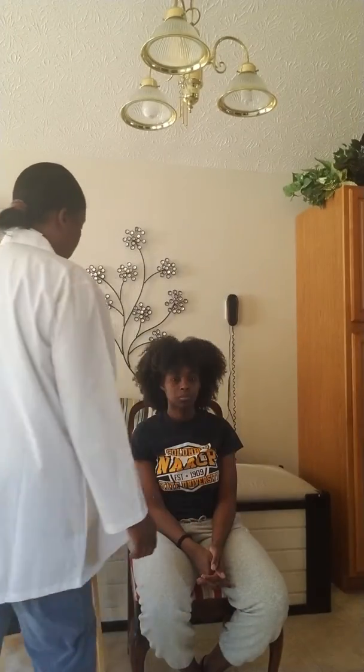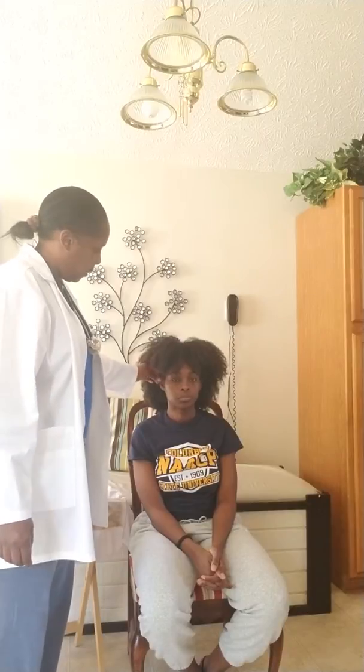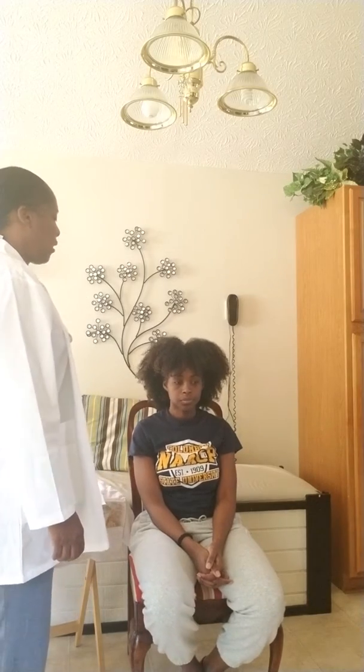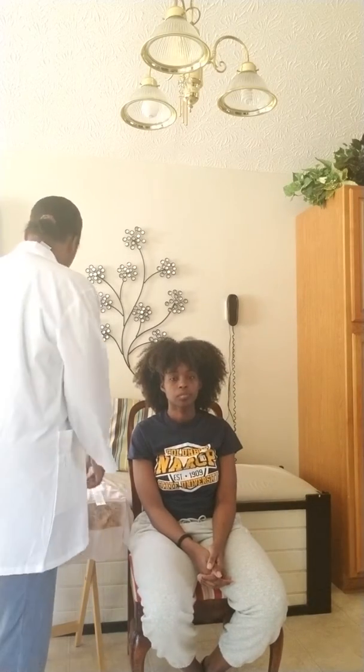So if she didn't have any pain with her left ear, I'm going to do the same thing with the right ear. I'm going to pull up on the pinna. Any pain? No. Any pain? No. No. So she didn't have any pain, so I could go ahead and begin my ear exam.